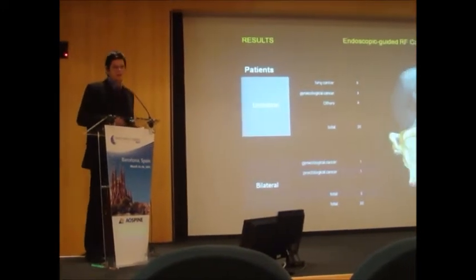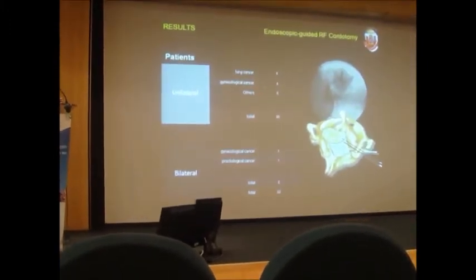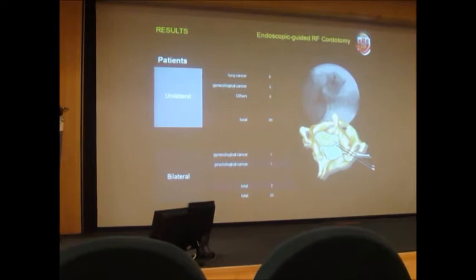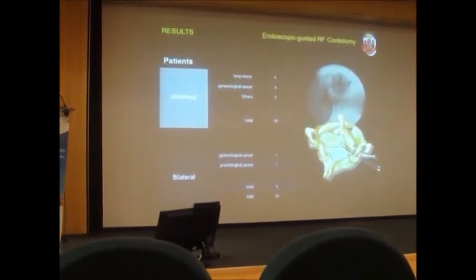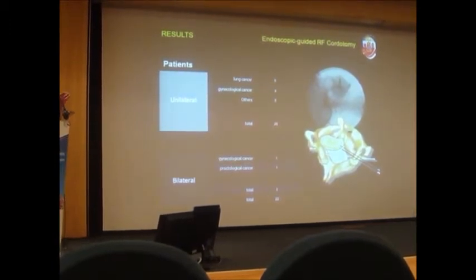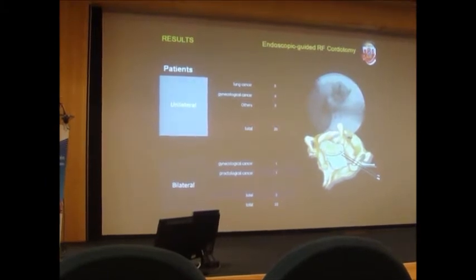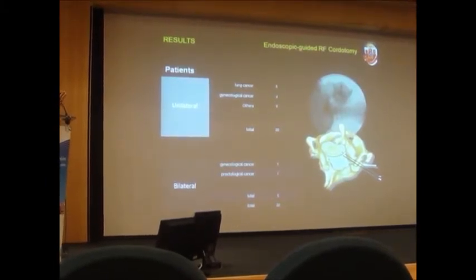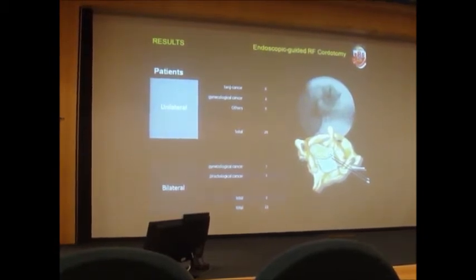So for this study we treated 20 patients with malignant cancer who did not respond to other options, like opioids, even opioid infusion pumps. This study was performed at Hospital das Clínicas in Sao Paulo, where there is a long experience, with more than 1,000 cordotomies performed with the fluoroscopy technique.